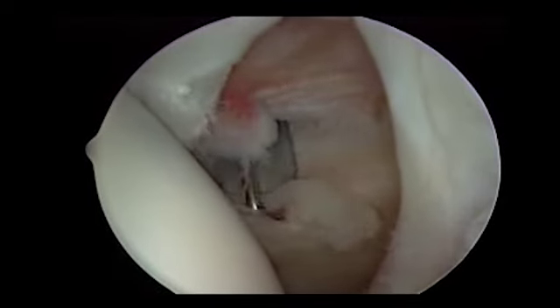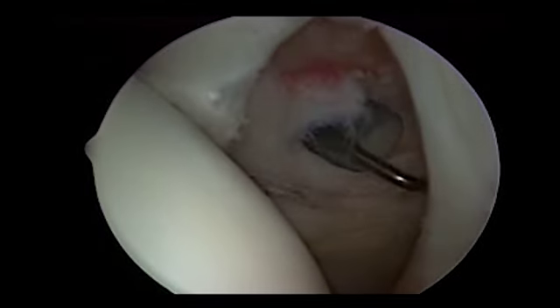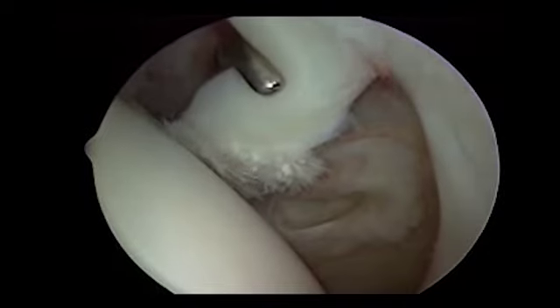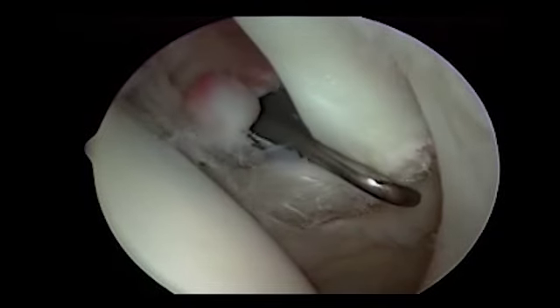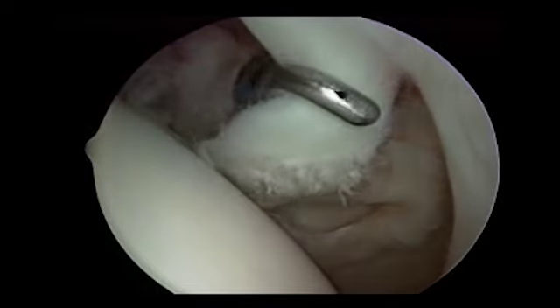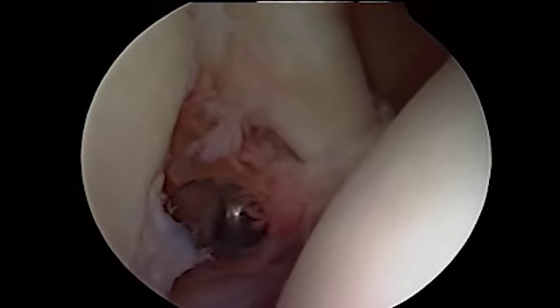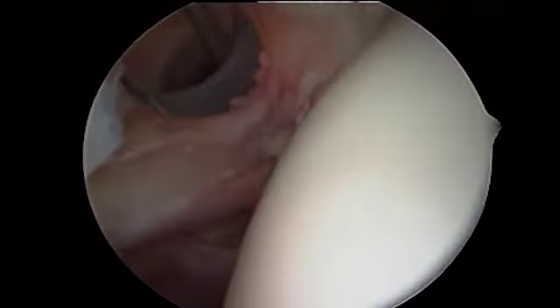In the second example, left shoulder, there's again pathology in the subscapularis identified and even more of a vertical orientation of the biceps, atypical for normal anatomy. Again, we can see significant intrinsic changes in fraying of the biceps, and when we push the biceps, we can actually see it subluxate or dislocate.